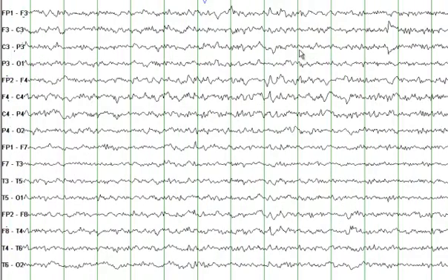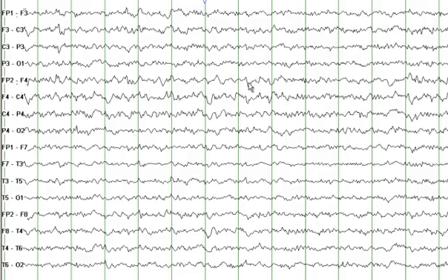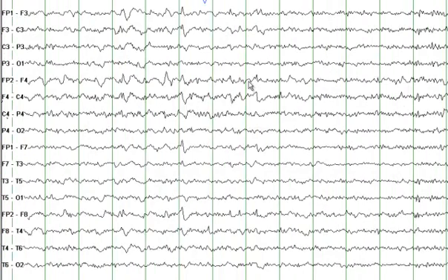Just to remind you, frequencies that are less than 4 waves per second — so frequencies of less than 4 Hz — are called delta frequencies. You can see this very slow wave here, which is in the delta range. In a normal adult EEG, you expect to see an occipital dominant alpha rhythm, which is not seen on this EEG.